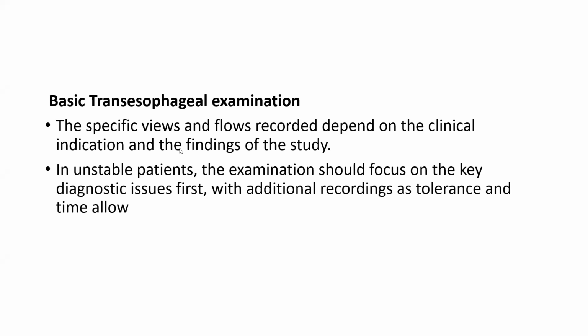Now, according to what you want from the study, anyone should make a plan when he starts to do TE. For example, I want to assess a mitral valve. Immediately I go to my target, finish my study to assess the mitral, and then assess the remaining structures.